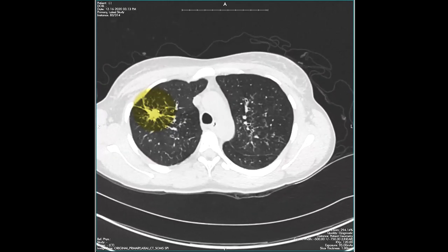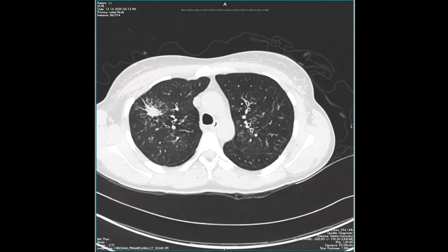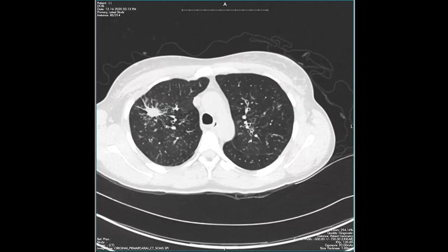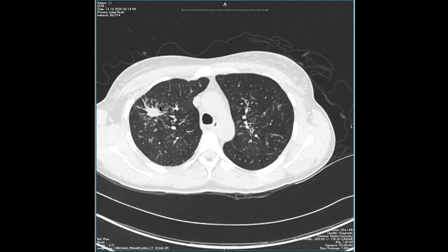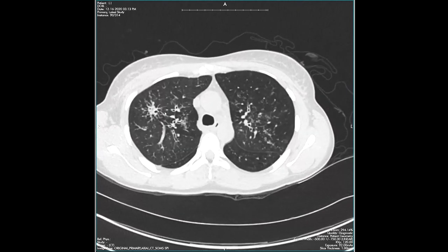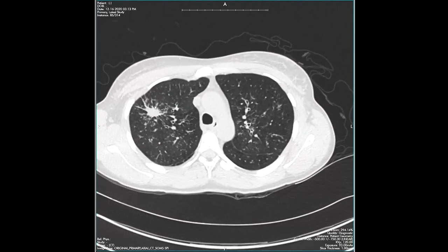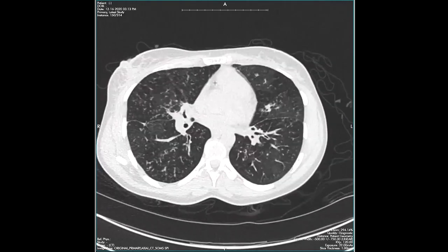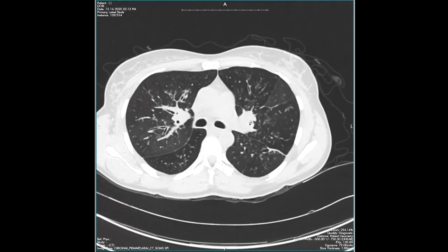In addition, we have this mass up here. Is this mass related to a separate process like a lung cancer, or is it related to sarcoid? Based on just this image, it would be really hard to know. You'd have to use comparison imaging to see if it was stable or gradually enlarging over time. In this case, the nodule was actually stable for several years. You can see larger confluent nodules in the setting of sarcoidosis — remember, we saw that with the galaxy sign, where we have little tiny nodules along the outer edges creating a more confluent nodule within the center.